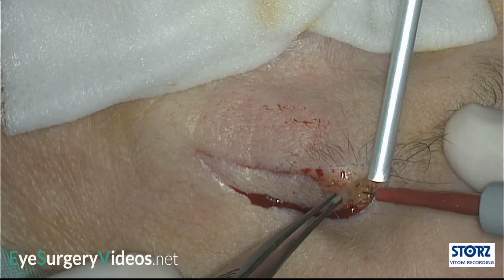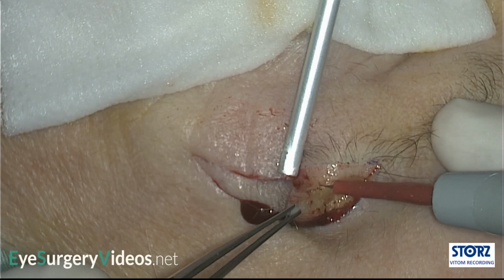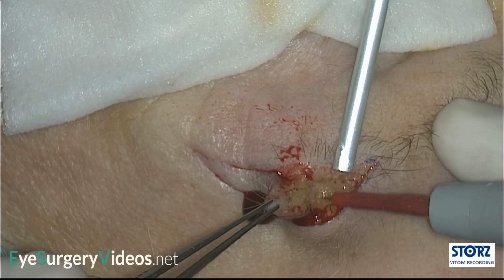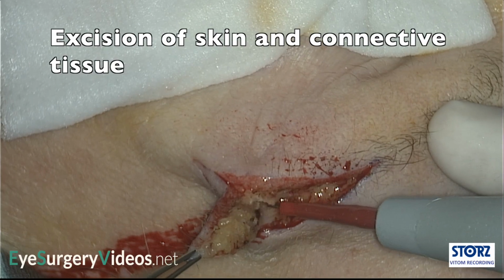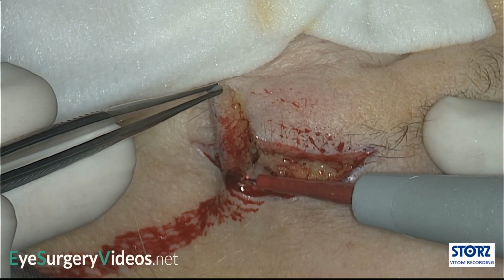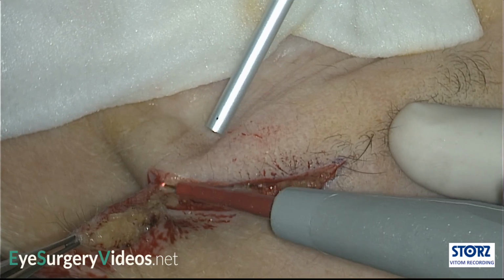Excision can be done with a blade, scissors, electrocautery, or monopolar diathermy, as you see here. The latter two may result in less bleeding, although it can still be a relatively hemorrhagic operation, at least for eye surgery. Knowledge of the anatomy of the scalp is important.